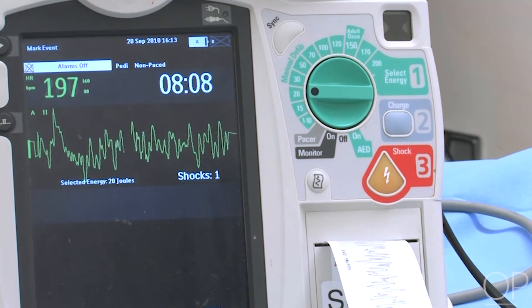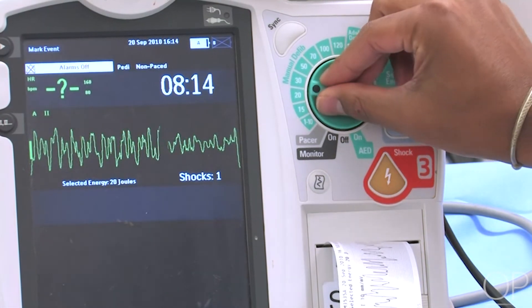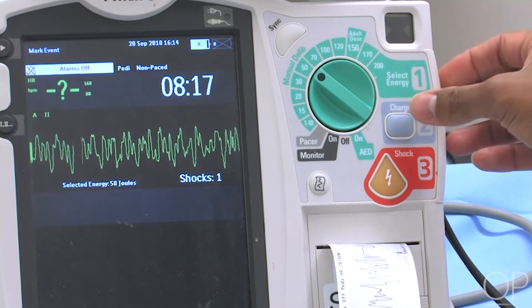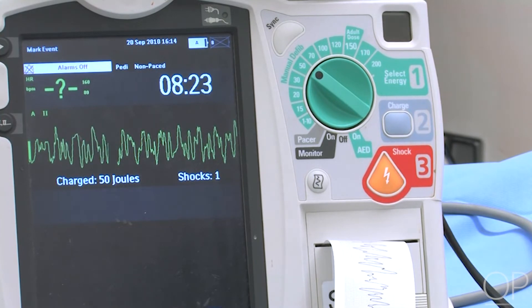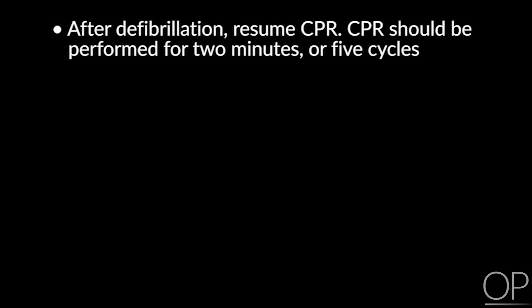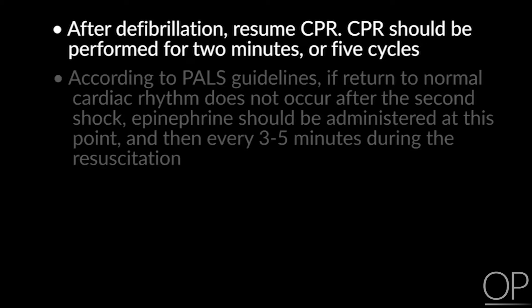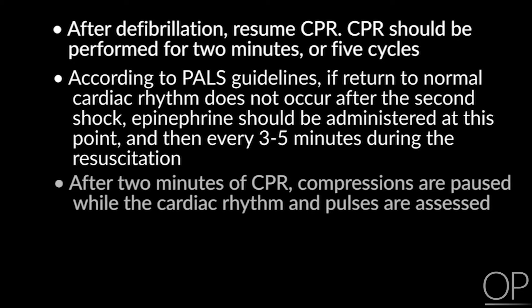It was an unsuccessful shock. The patient remains in a hemodynamically unstable ventricular fibrillation. We effectively double the voltage, going to the 4 joules per kilogram mark. We charge the device. 'I'm clear, you're clear, we're all clear.' We deliver our second shock. After defibrillation, resume CPR for 2 minutes or 5 cycles. According to PALS guidelines, if return to normal cardiac rhythm does not occur after the second shock, epinephrine should be administered, and then every 3–5 minutes during the resuscitation.